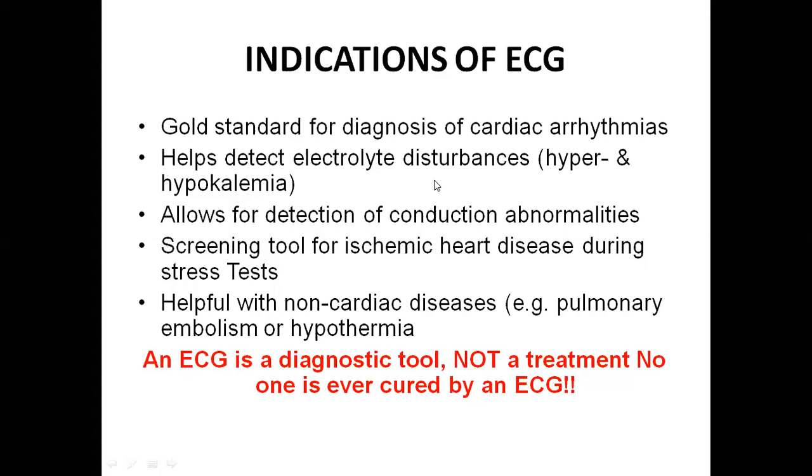But this is very important, that ECG is solely a diagnostic tool. It is not a treatment. It is not a solution to get the abnormal patient back to the normal condition. It can only be seen, or notified, or diagnosed that a particular human body's heart is not functioning properly. It is only a diagnostic tool. It is not a curative tool. Okay.